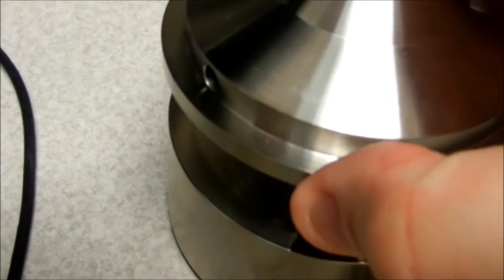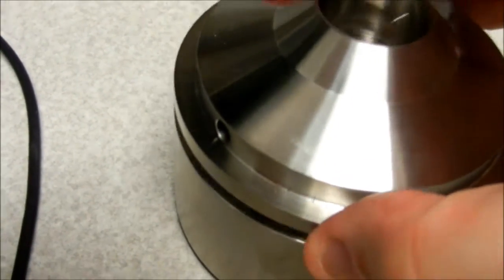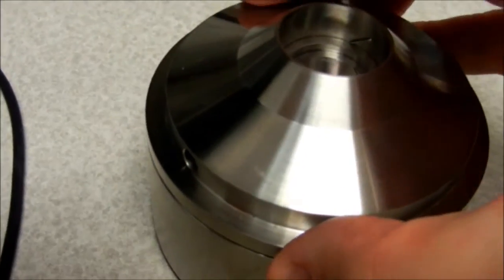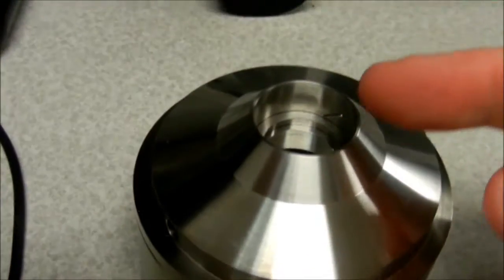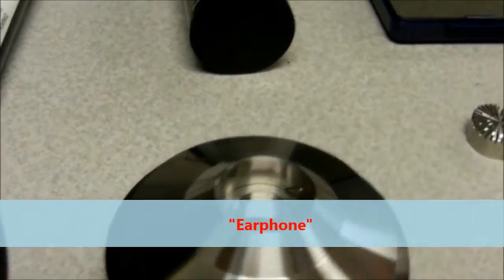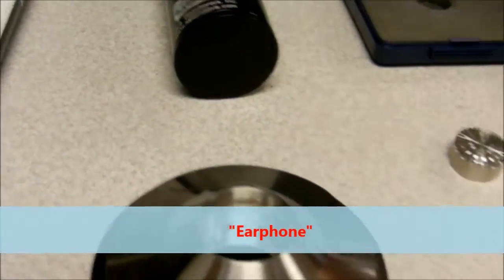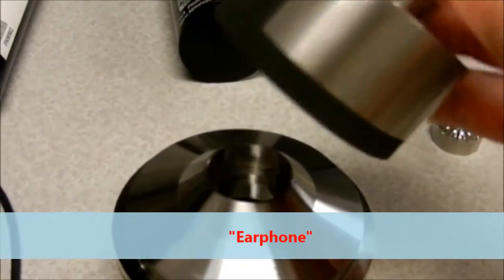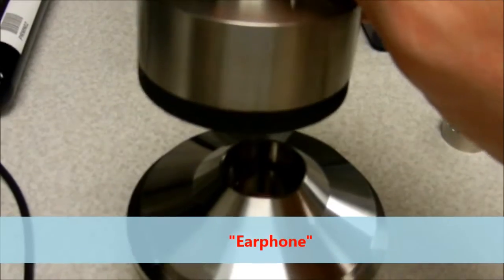And we place the coupler back on top of the artificial ear and the microphone sits on top here, along with the weight on top of the microphone.